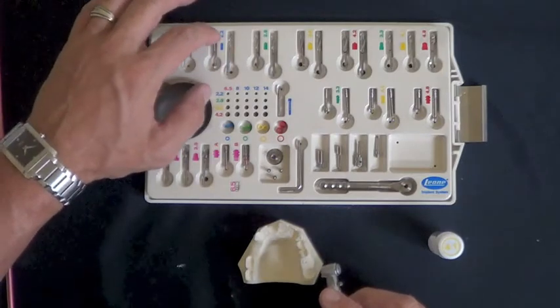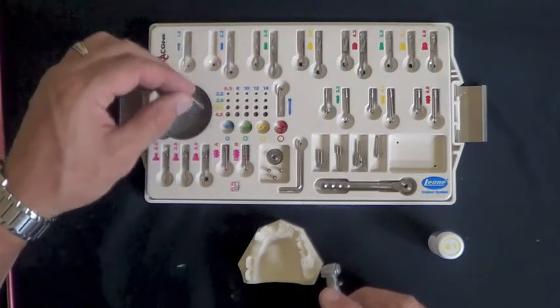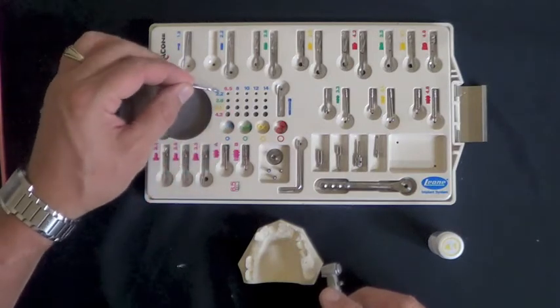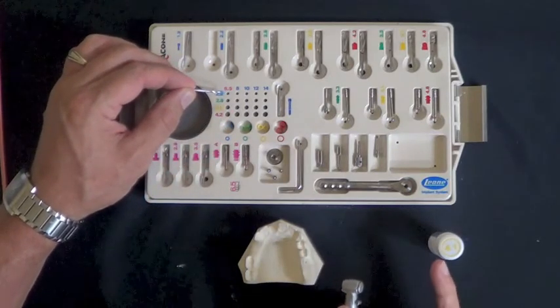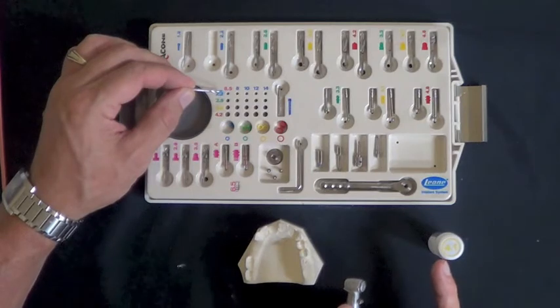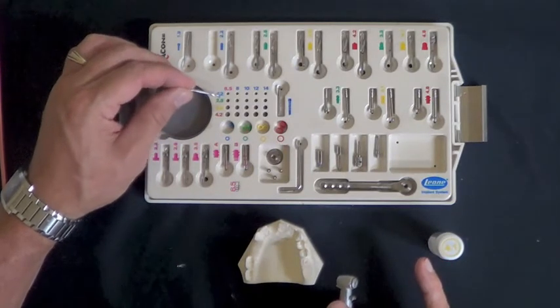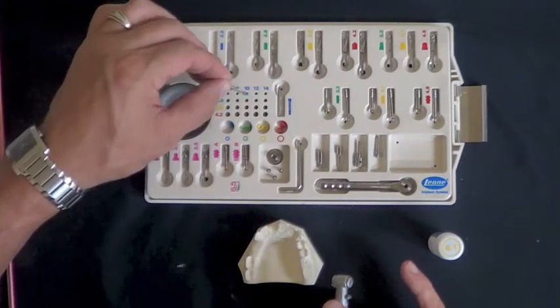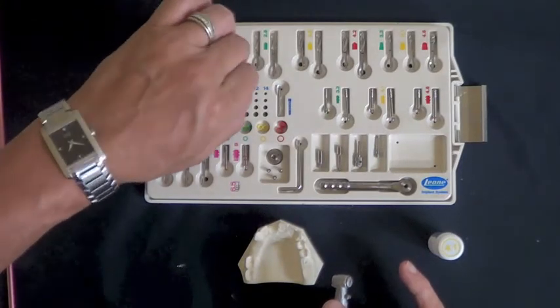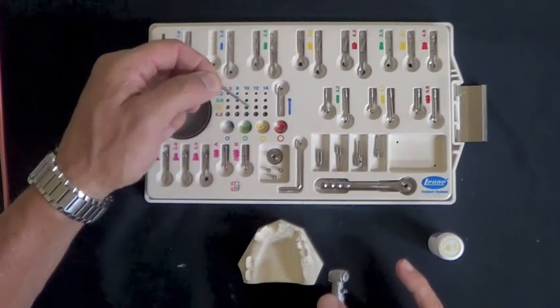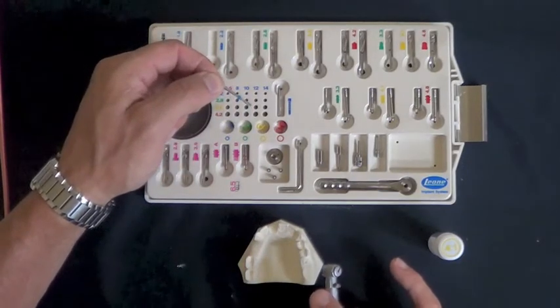Following the round burr, generally we would use the pilot drill, the 2.2 drill, and place a ringlet on the 2.2 drill. The implant that we're going to plan to place in this model is 4.1 millimeters in diameter by 10 millimeters long. So after placing a ringlet on the pilot drill, we would put it in the 10 millimeter length. That would give us our depth that we'd want to drill into the osteotomy site.